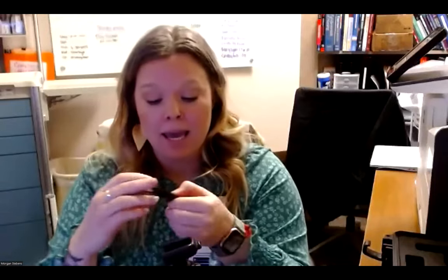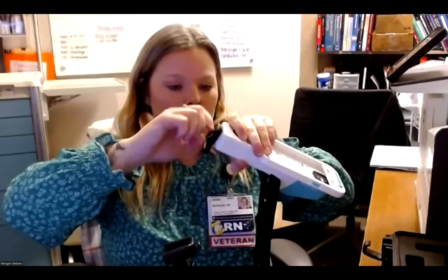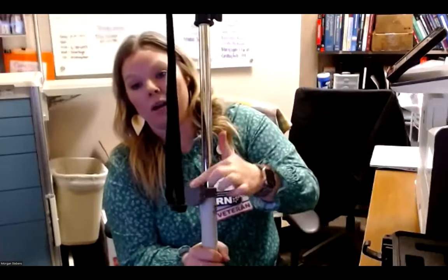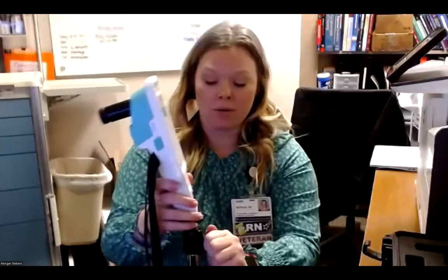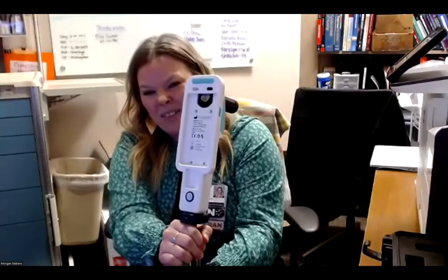This piece right here is a screw. You pop up this little thing back here and you plug it in and then you screw it in. That's what it looks like, and then you can slide it and your device goes in and you're hands free. You can move it up and down. There's a knob right here to move it up and down. It just tightens and loosens. This knob right here actually moves the camera for you. It's a little loose, so you want to make sure that all of your pieces have the appropriate screws so that it doesn't move. This lets you move the actual camera around so that you can be hands-free.